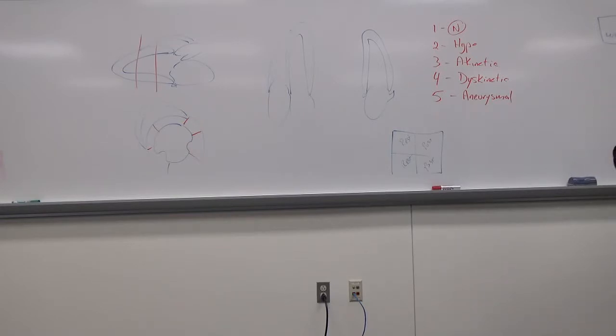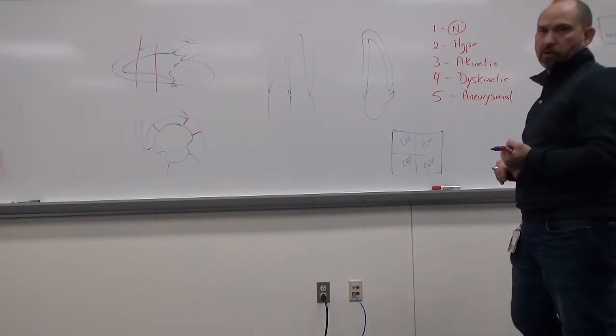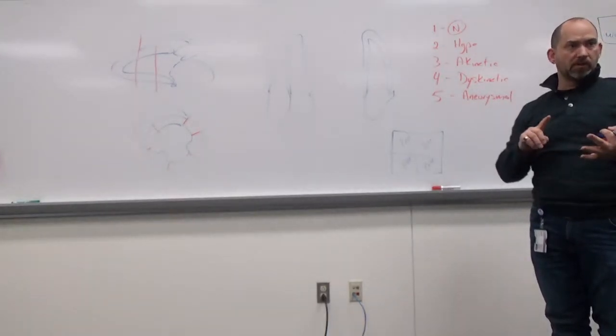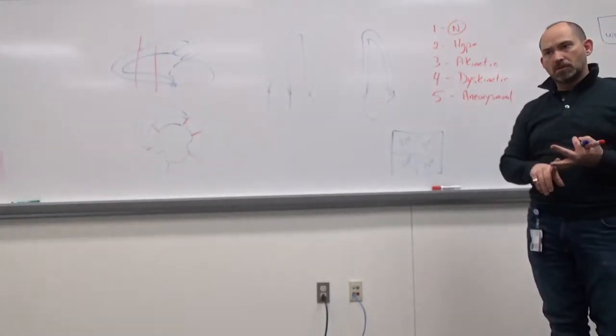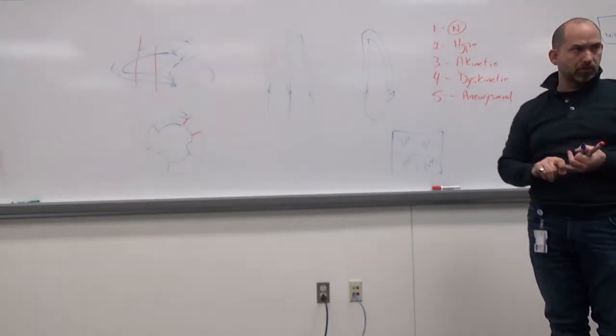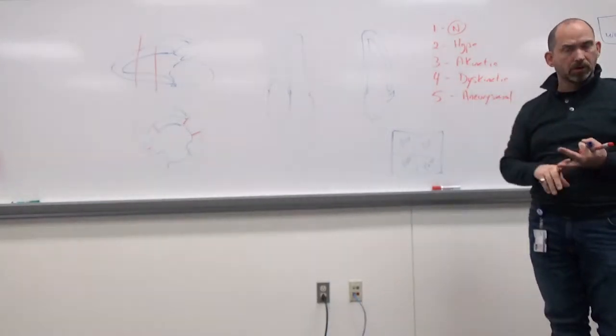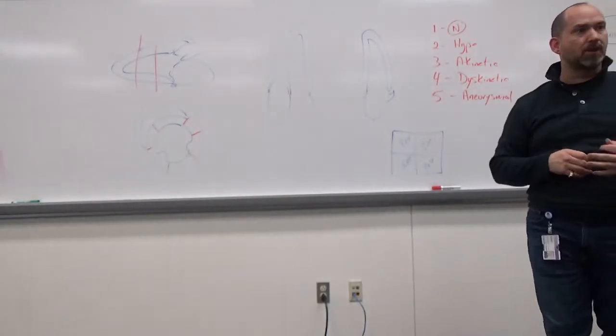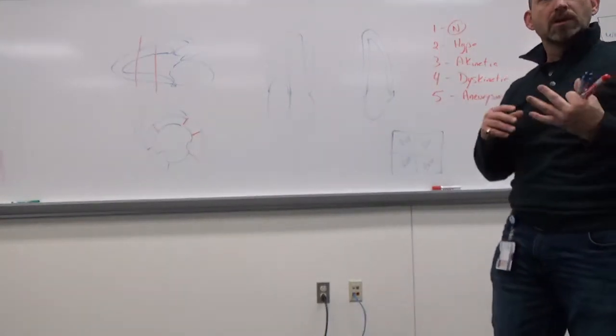So what are normal changes that we're looking for in a stress echo? What do you expect the heart to do when it's exercised? Increase the heart rate. Okay, increase heart rate. Increase contractility. Okay, so a decrease in systolic volume for sure, so it's going to be squeezing harder. My ejection fraction goes up typically, so a bigger amount of blood is getting ejected out of the heart.